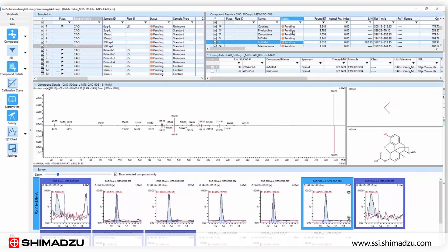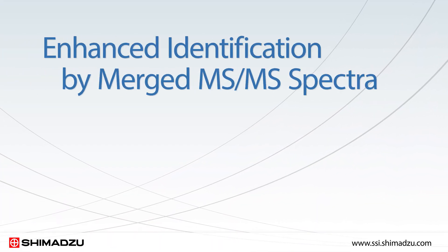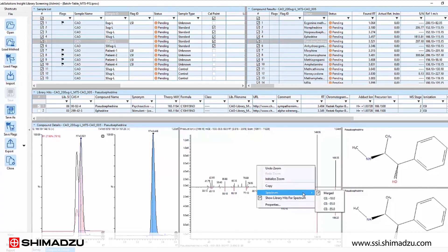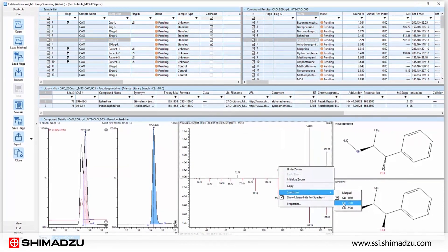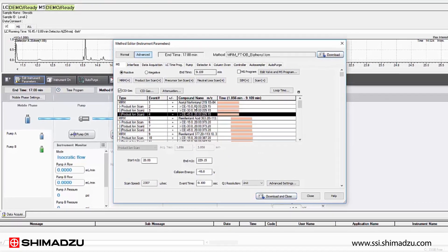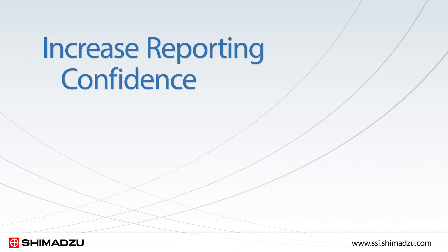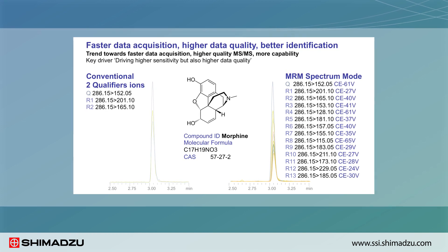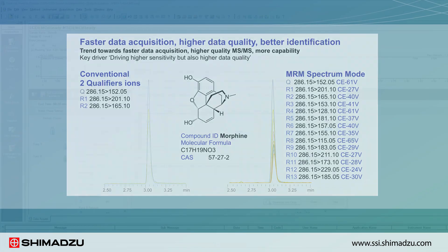Search against thousands of forensic and toxicology related compounds for targeted compound screening and quantitation. Shimadzu's Lab Solutions Insight software uses three MS/MS spectra with three different collision energies to increase specificity and reporting confidence. The synchronized survey scan feature allows you to automatically trigger three different MS/MS scans for high quality spectral matching. Lab Solutions Insight also enables you to produce high quality results without the need to define a threshold value to trigger an alert, decreasing the chance of false negative and false positive reporting.